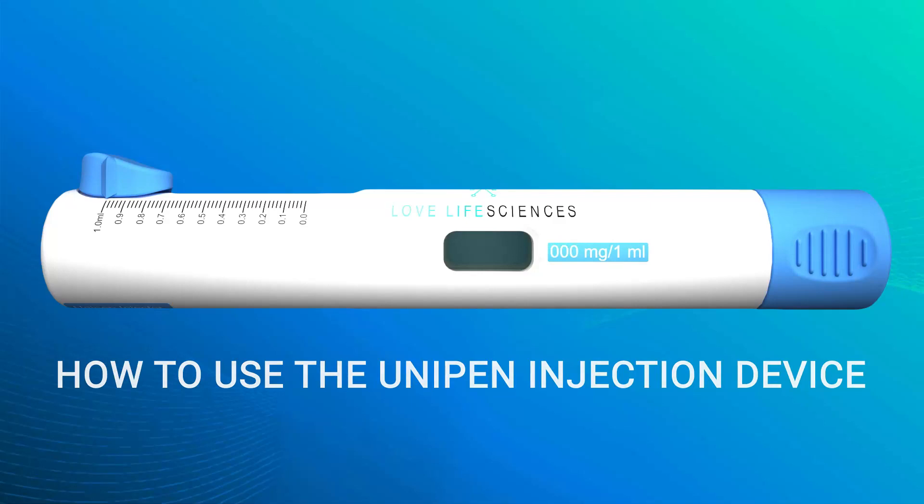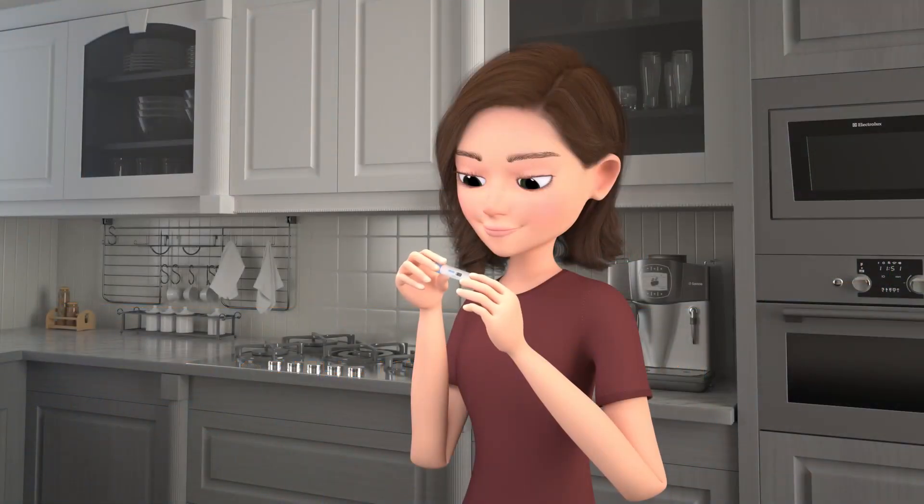This video will demonstrate how to use the UniPen injection device. First, inspect your UniPen to ensure it doesn't appear broken.